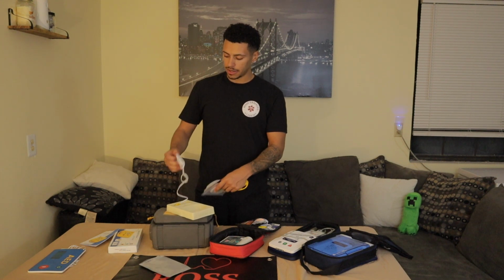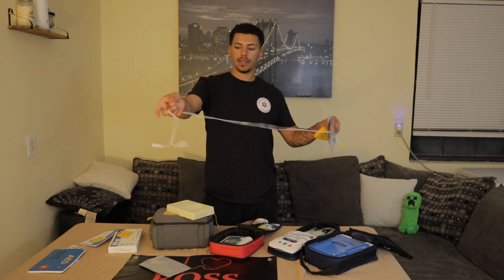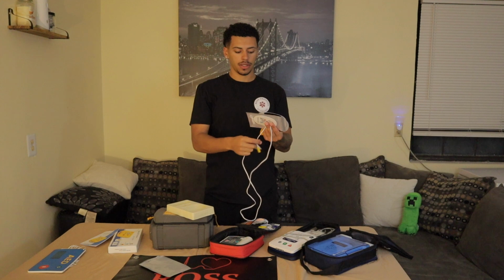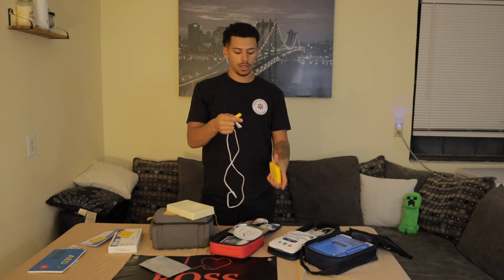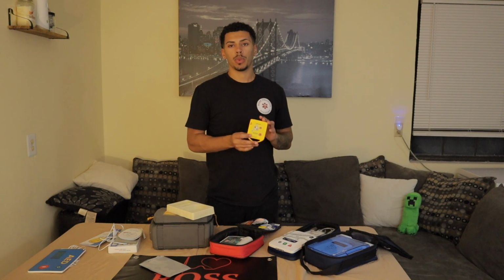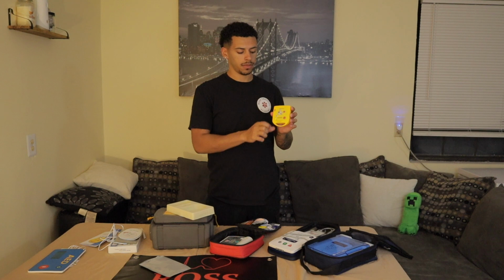It'll come with a set of wires, and this is how you connect it to the pads with these two ends, and then this end is how you plug it into the AED itself. So this one doesn't do a whole lot, but we'll turn it on so you guys can hear what it sounds like.